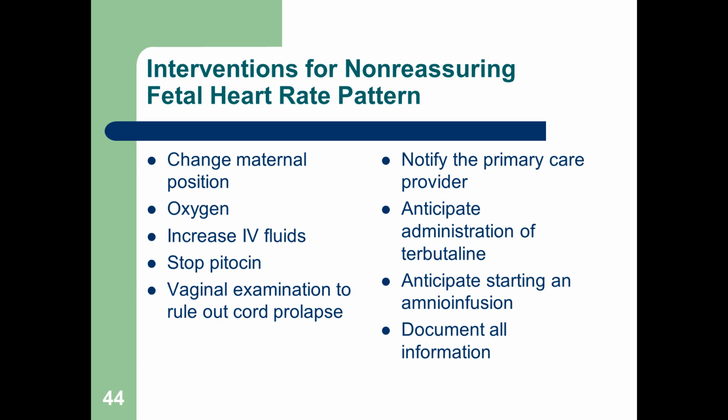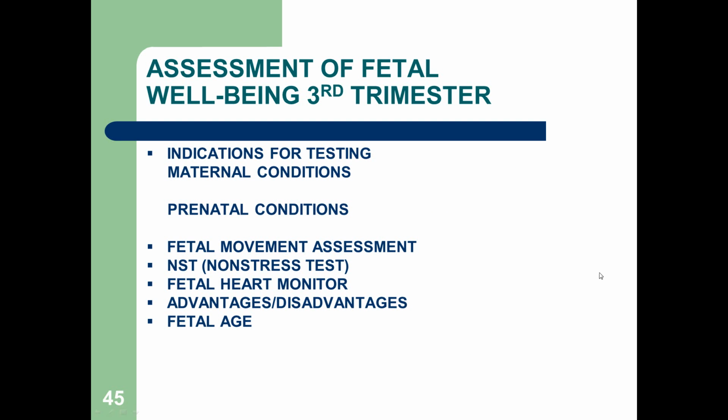And in cases of lawsuits involving OB patients and such, they're going to look at the monitor strips. They're going to look at the record in labor and delivery, especially if you get a baby that has been fine throughout the pregnancy and then they're delivered with problems. They're going to look at your strips. So always document what's going on, okay?